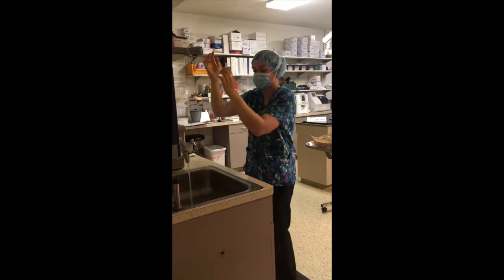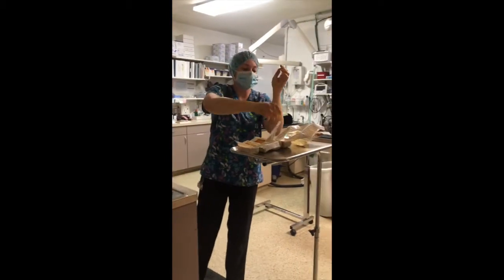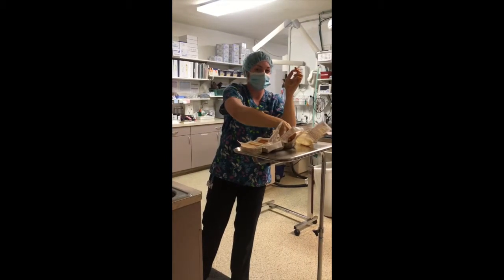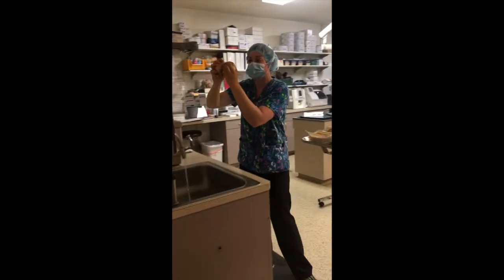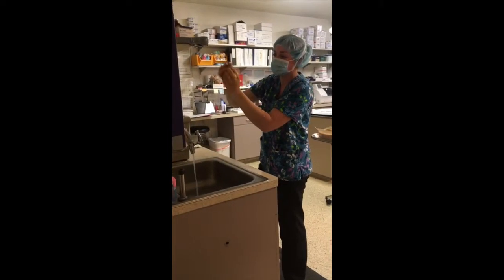Okay, dropping that in the sink. I'm going to come over and I'm going to grab my next one. This is my second set. And we're going to repeat the process again.